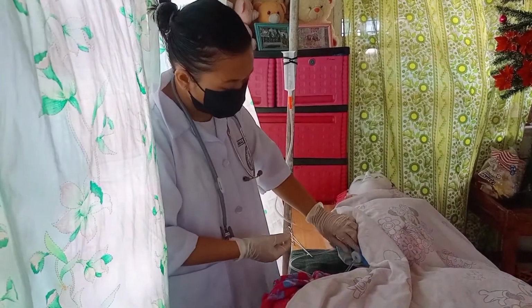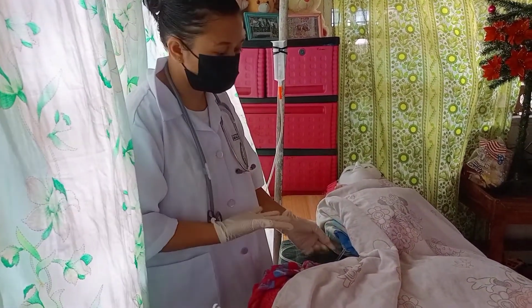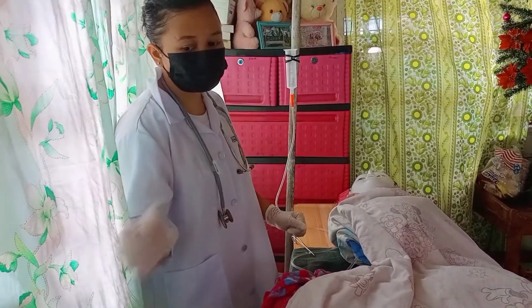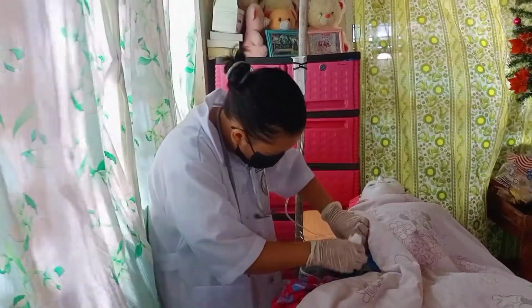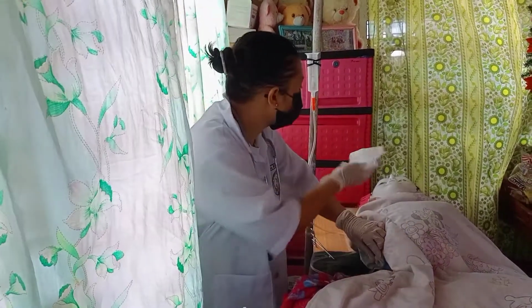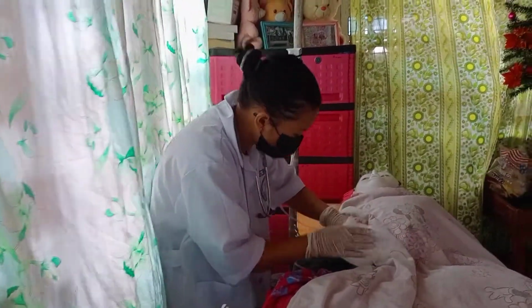The rationale of this is that the air instilled into the rectum, although not harmful, causes unnecessary distension. So, ma'am, i-withdraw ko na po yung tube po, ma'am. Dahan-dahan lang po. Okay po, ma'am.